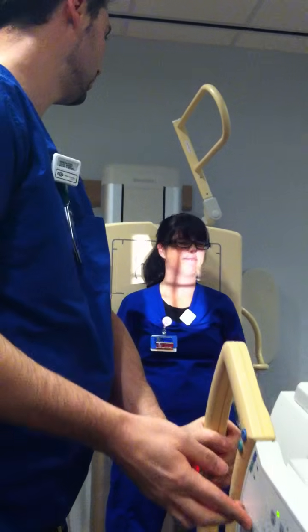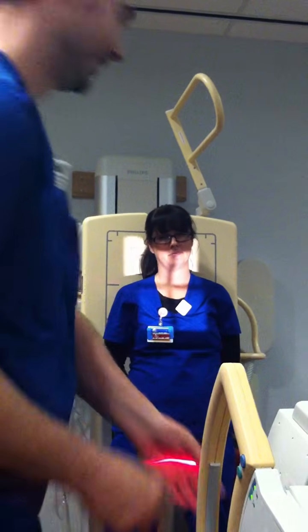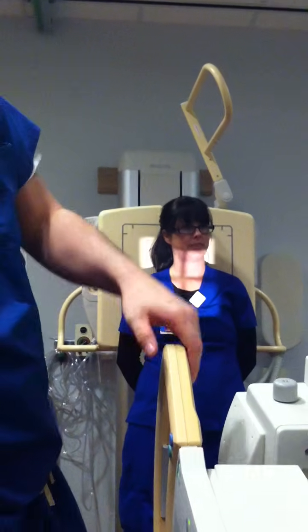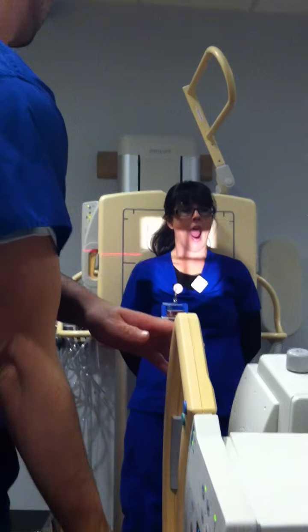Keeping my angle. Let me keep that right in your eyes. Here's your trauma line. These are obliques.